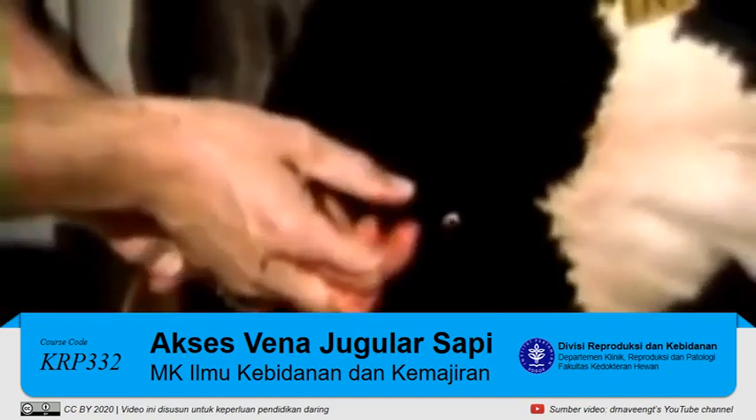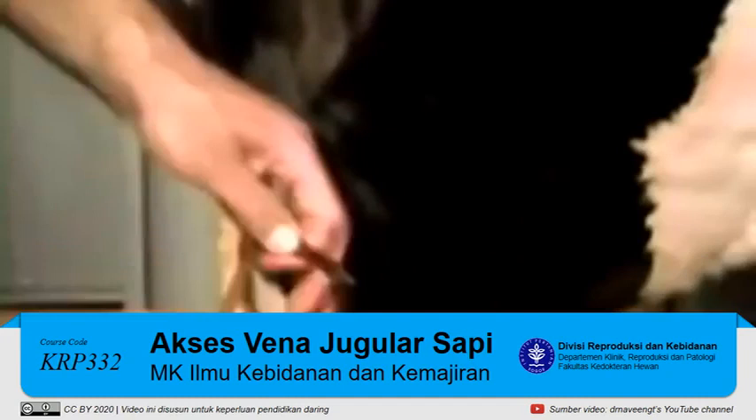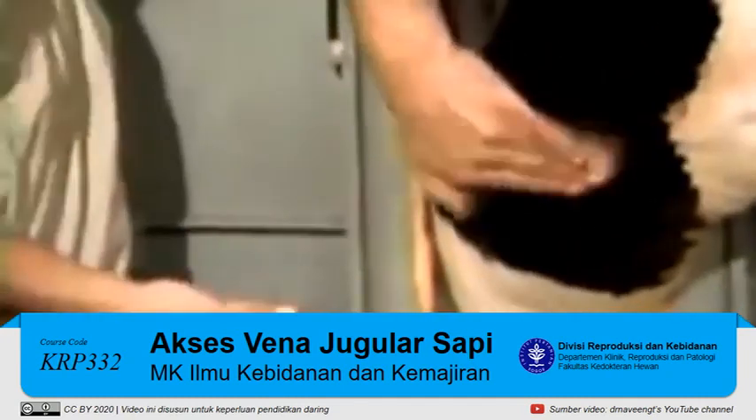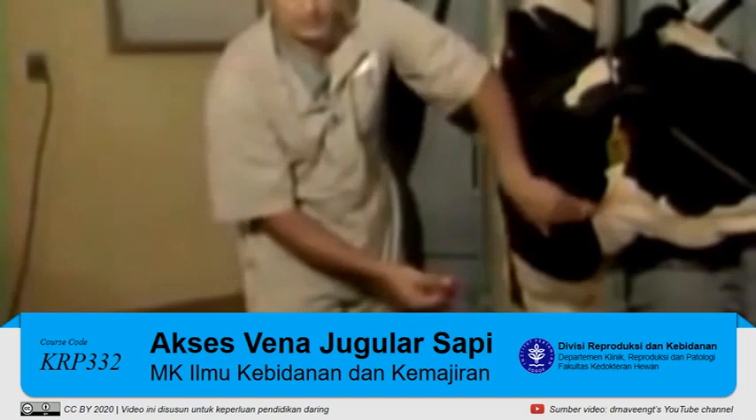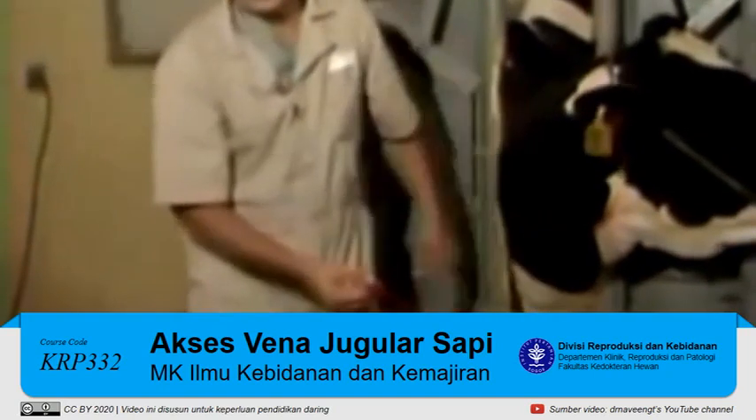When we're finished giving the administration, we give it a quick thrust to pull it out, and then always rub the vein out very well to make sure that she doesn't have some leakage and a paravascular hematoma.